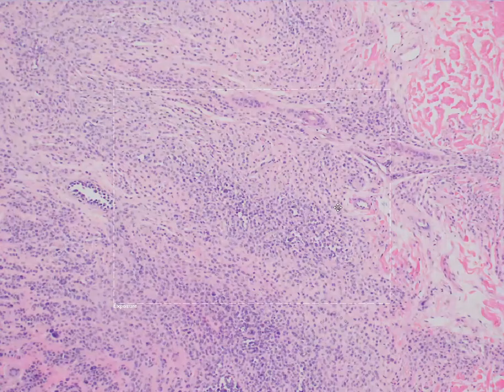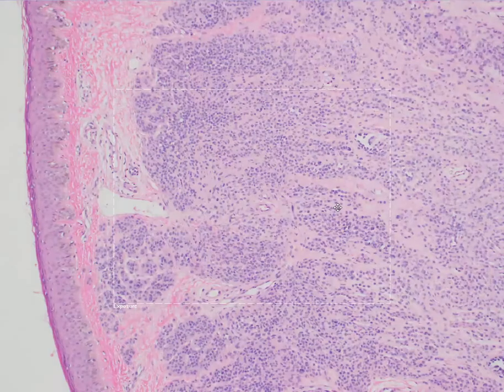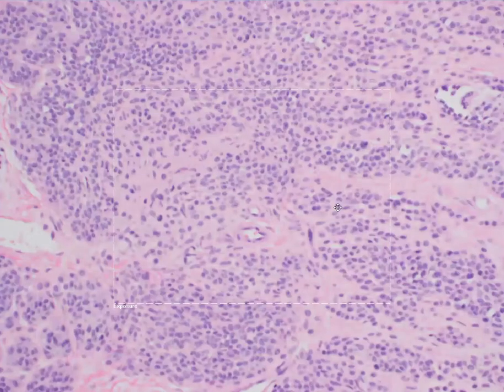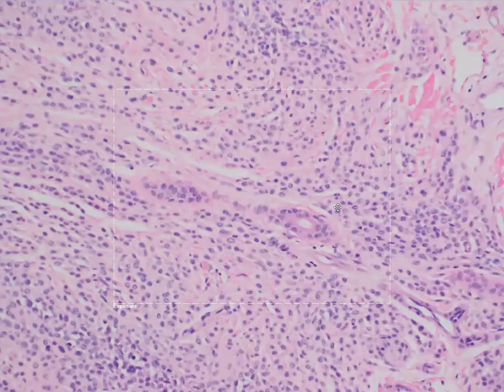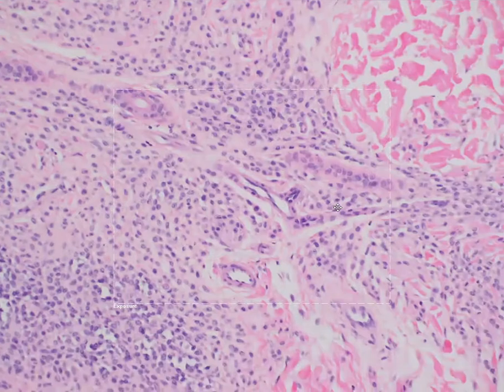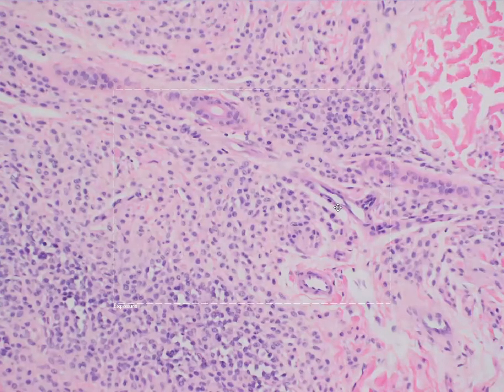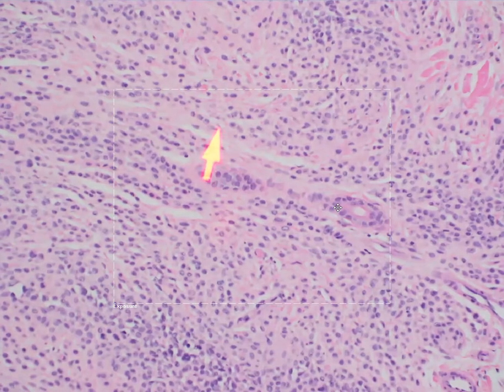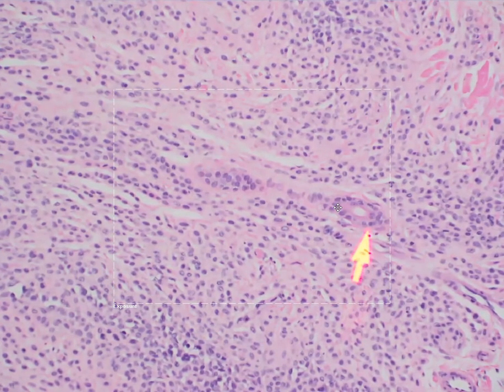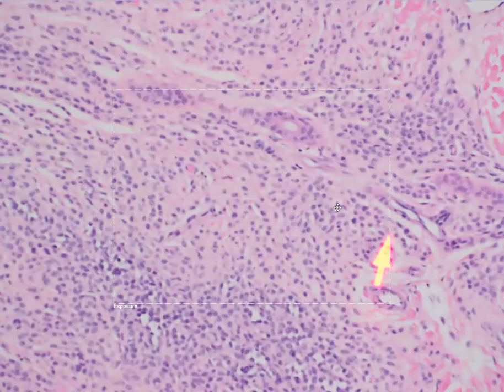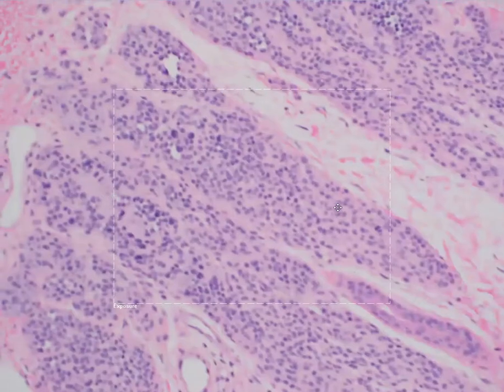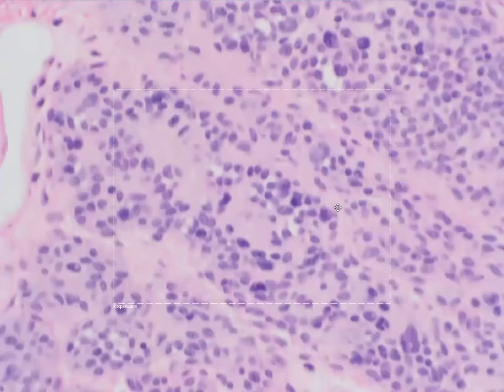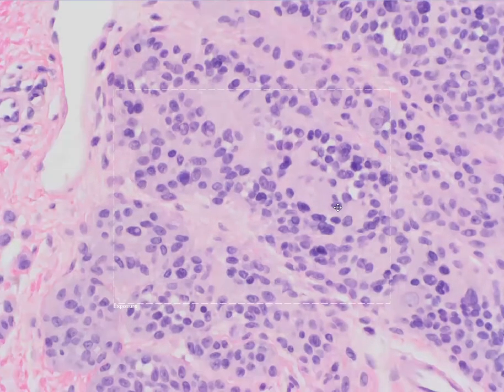This phenomenon of nested melanocytes that break up into single melanocytes with descent into the dermis is called maturation. Another characteristic of maturation is that the nuclei of the melanocytes decrease in size with descent into the dermis. That is a phenomenon you expect to see in benign melanocytic proliferations and is lost in atypical proliferations. You can also see how the melanocytes stream around adnexal structures — those are eccrine ducts coming up through the dermis.